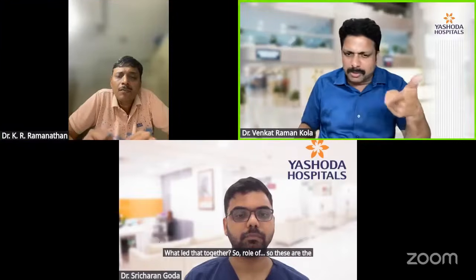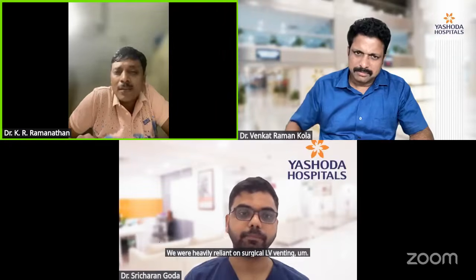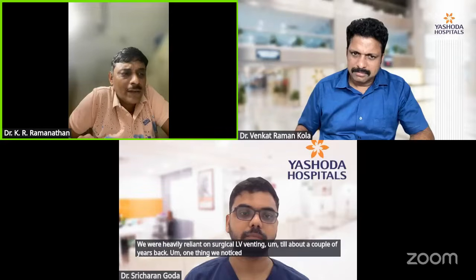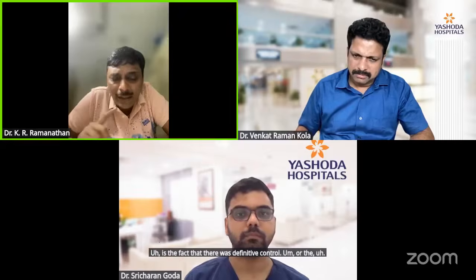So are these the two options? You never go for any other modalities? We were heavily reliant on surgical LV venting until about a couple of years back. One thing we noticed with surgical LV venting is that there was definitive control over the venting side of things.